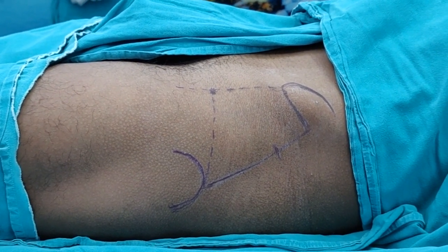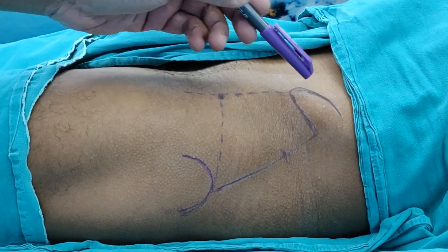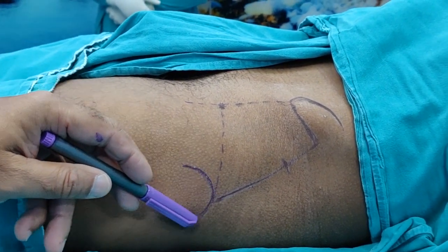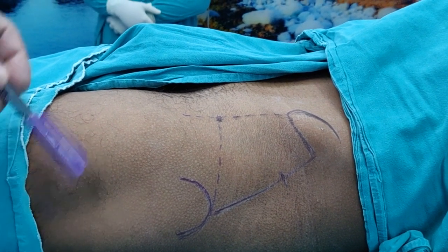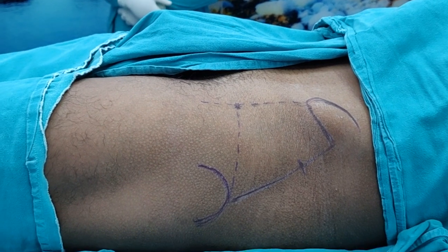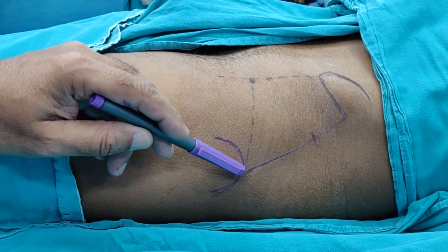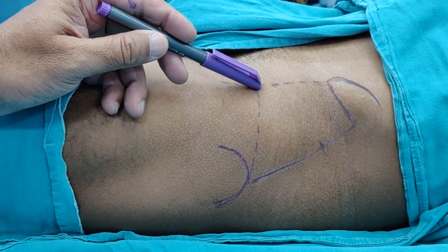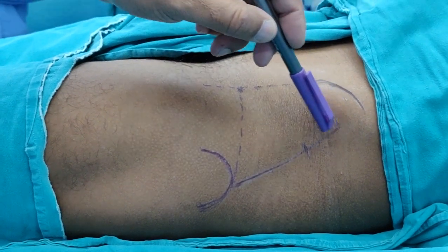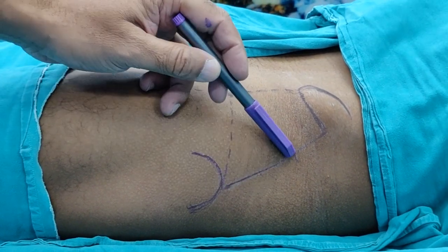I have marked the ASIS — the anterior superior iliac spine — and this is the greater trochanter, marked using the C-arm. The first line I have drawn goes from the ASIS to the center of the patella. The second line starts from the tip of the greater trochanter and meets with the first line at our target point. From ASIS to GT, I have divided this roughly into one third and two thirds.